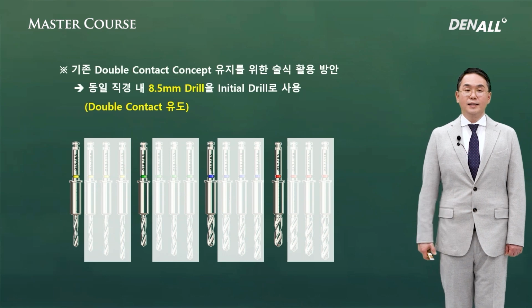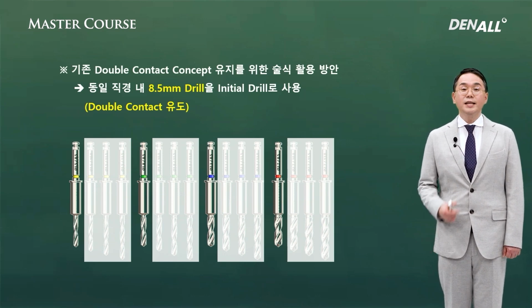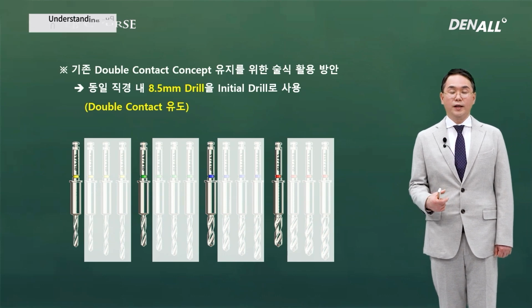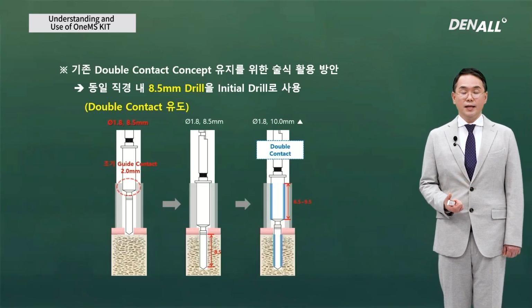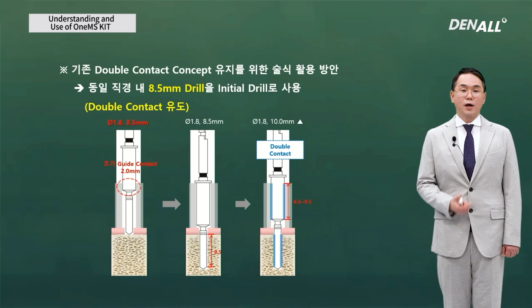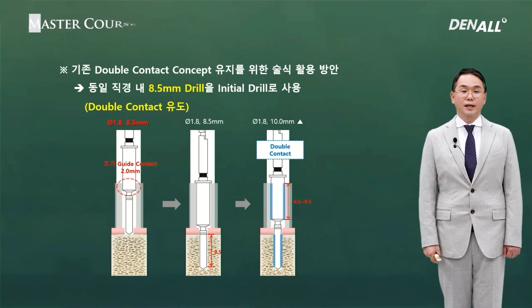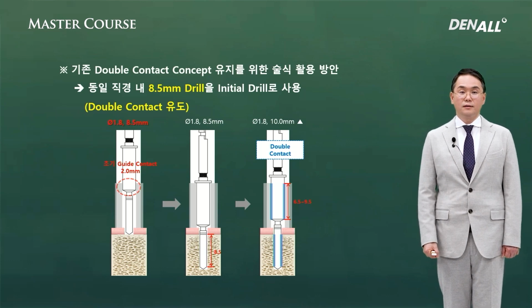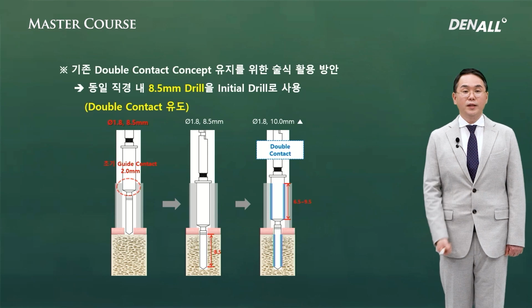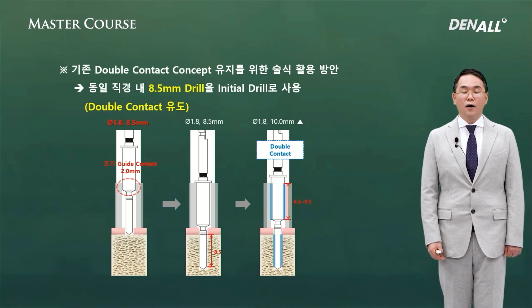In the previous lecture, I talked about the importance of initial drilling with one guide. For initial drilling, the guide barrel of the drill should come in contact with the inside of the guide hole. If you use the long OneMS drill directly, the drilling starts without contact with the guide. That leads to inaccurate drilling. The angulation of the drilling can change or the drill can slip.